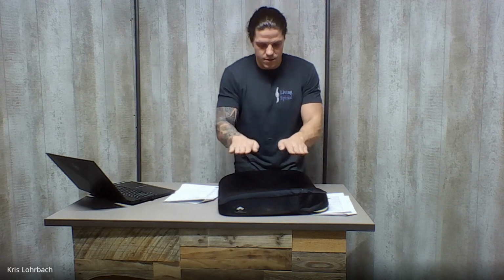Then this whole section is going to be lowered a little bit. This is for people who have posture where they're sitting like this. It brings them back down and they're sitting forward again. Pretty much any time I've ever had to get an anti-thrust cushion for someone, they knew that they needed it. They're like, yeah, my PT says I have to have anti-thrust.